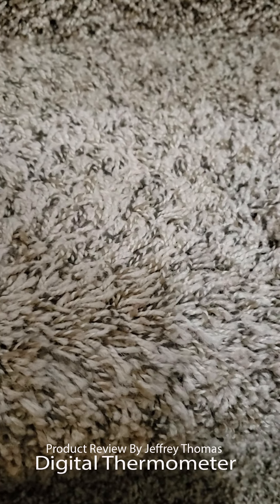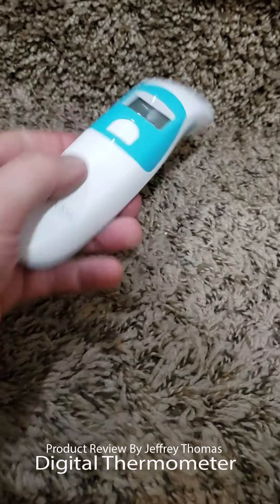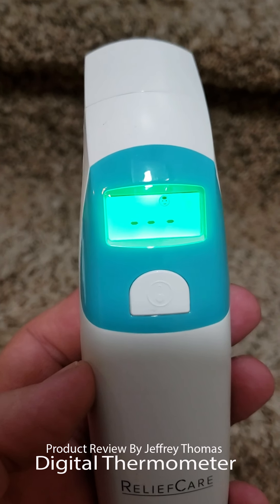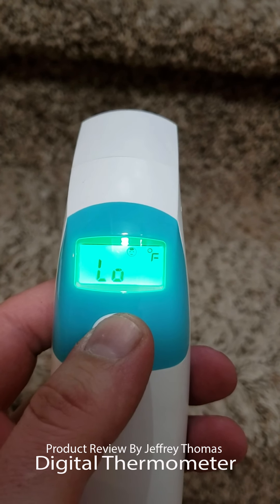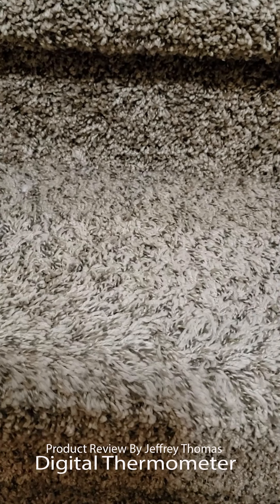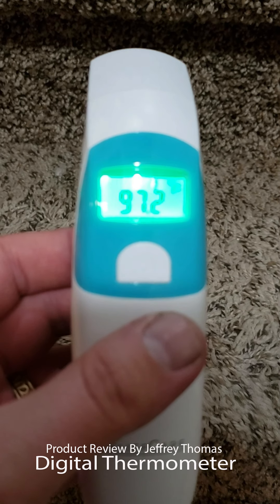Here is the unit. It's a little hard to do with one hand but I'll do my best. You can see the temperature there — it's set up in Fahrenheit. To take a temperature, you just run it across a person's forehead. That's actually my temperature right there, taken on the forehead.